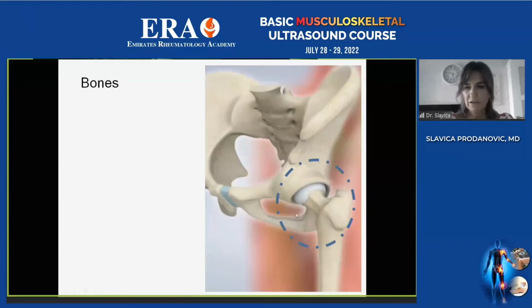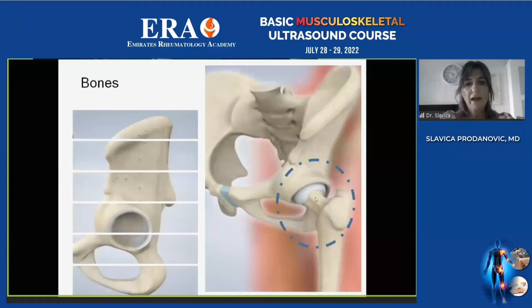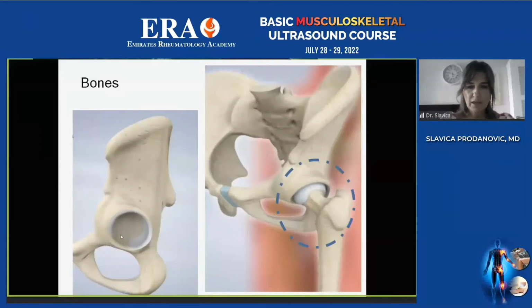Actually, this is the head of the femur and part of the neck, and the articular surface of the acetabulum, actually the socket of the acetabulum.